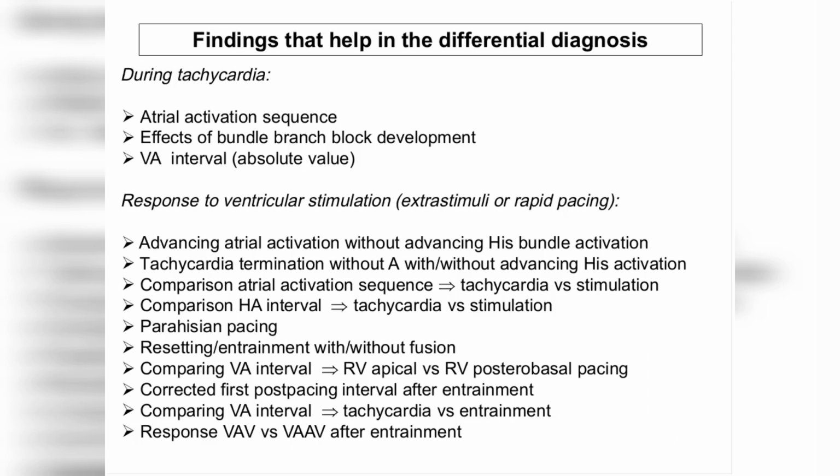Along with examples, we will propose some questions with multiple choice answers, and you will have the opportunity to vote.